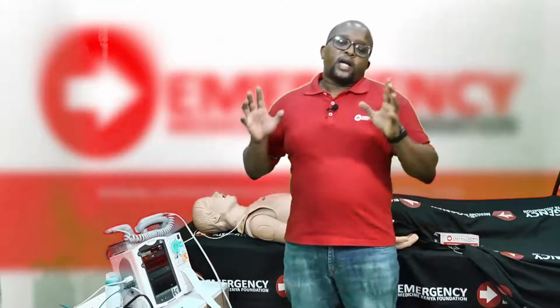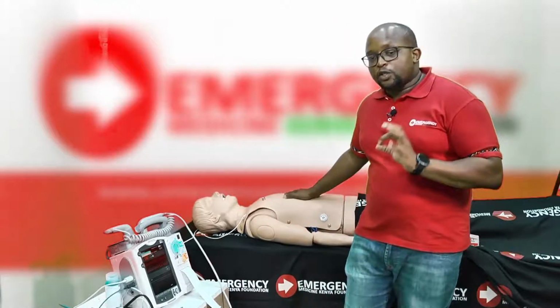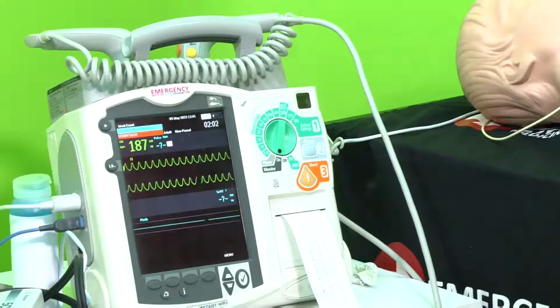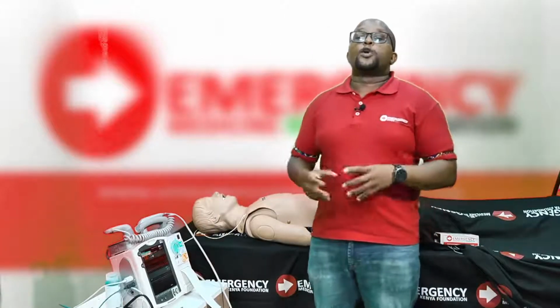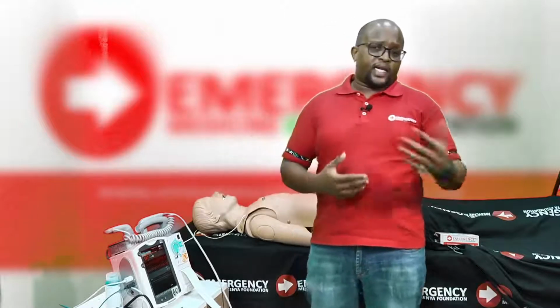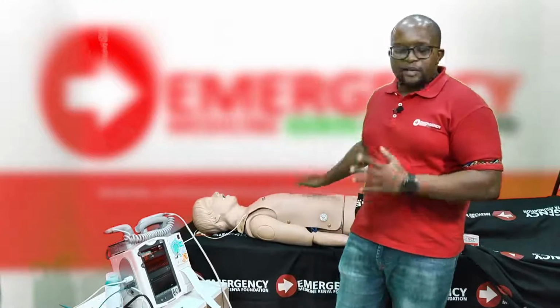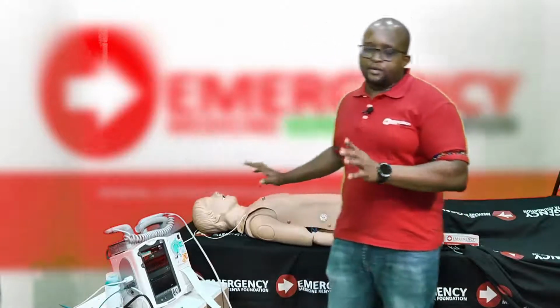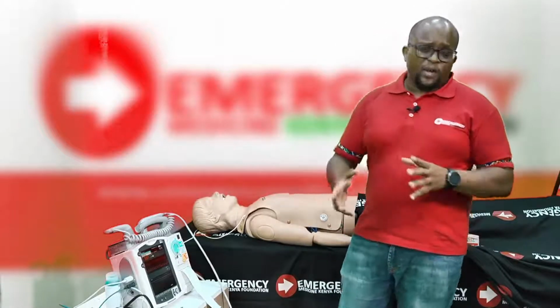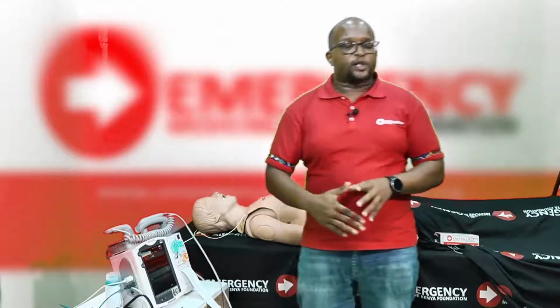Now, cardioversion, as I said, your patient is alive, so the first thing I want to do is give them some medication to sedate them a bit and give them a bit of pain relief, all right? Because they're already hypotensive, you don't want to load them with large doses of sedatives and analgesia. So potentially I'll give them maybe 1 to 2 milligrams of midazolam, and then maybe 25 or 50 micrograms of fentanyl, whatever you have available, but do not give too much analgesia that will make the blood pressure drop further. Remember, the main thing is we need to correct this.